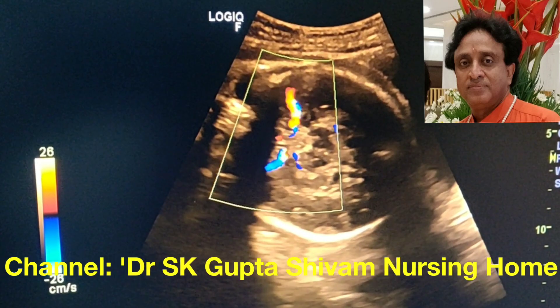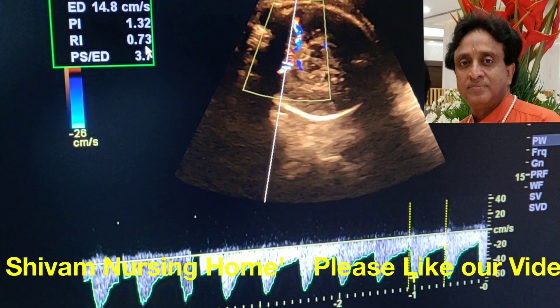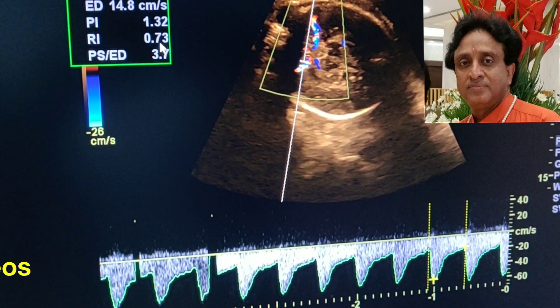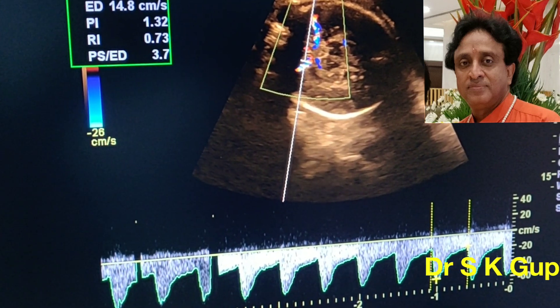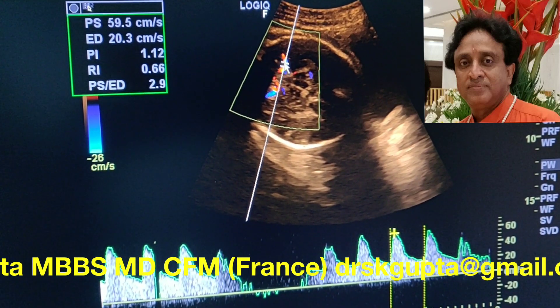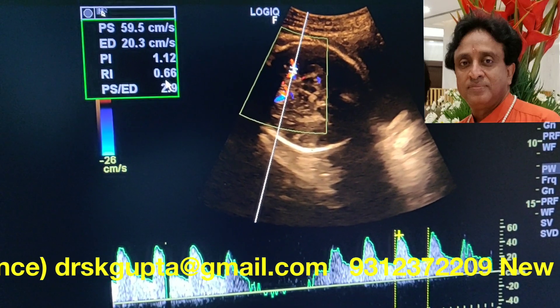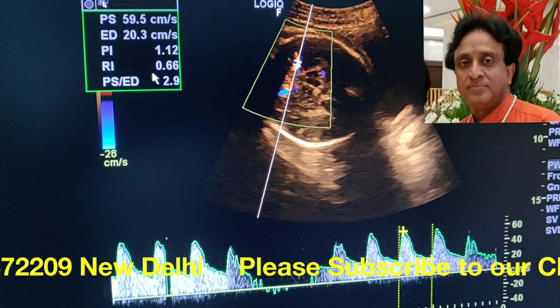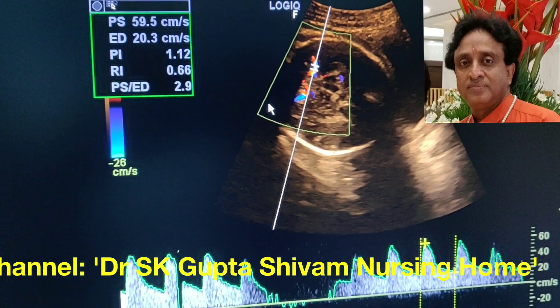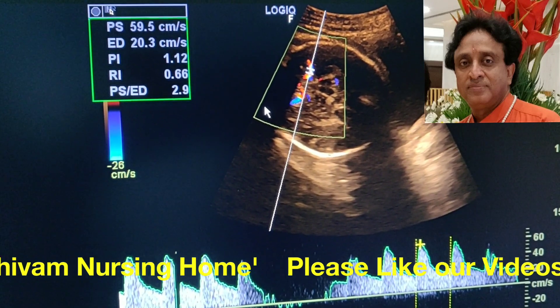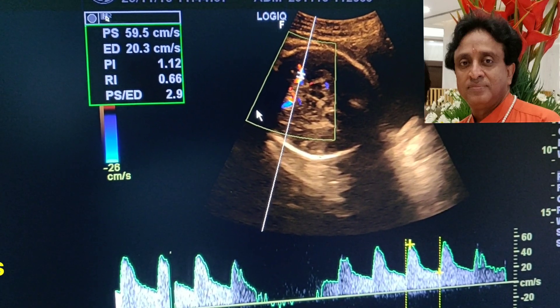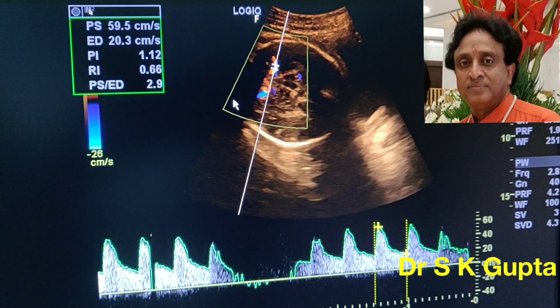This is the color Doppler scan of the middle cerebral arteries — both are beautifully seen. Normally the resistance index of the middle cerebral artery should be more than 0.8, but here it is 0.73 on one side and 0.66 on the other side. Both values are low, indicating a brain sparing effect where more blood is being diverted to the brain, giving rise to lower cerebrovascular resistance.